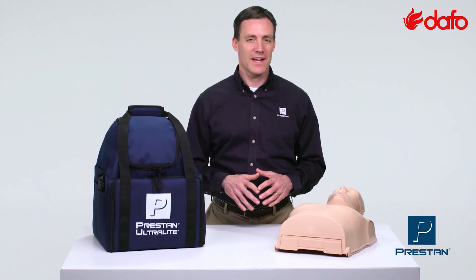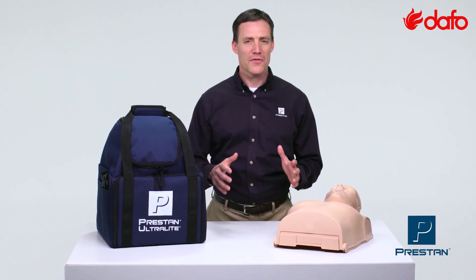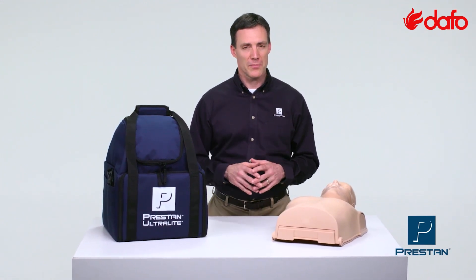The Preston Ultralight Mannequins — a compact, portable set of mannequins — perfect for on-the-go training with the same quality and durability you've come to expect from Preston.